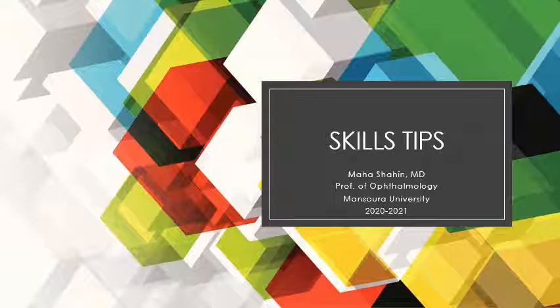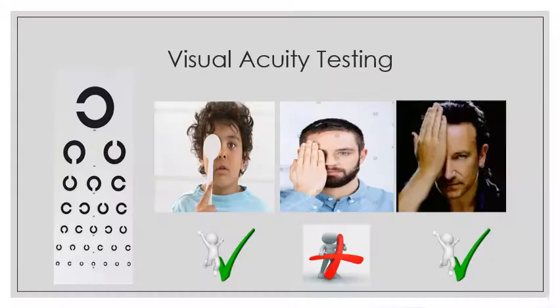Today we are going to discuss important tips while performing different ophthalmological tests. On the top of these ophthalmological testing is the visual acuity testing.